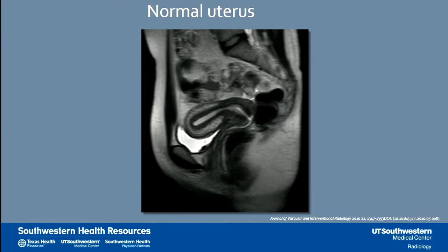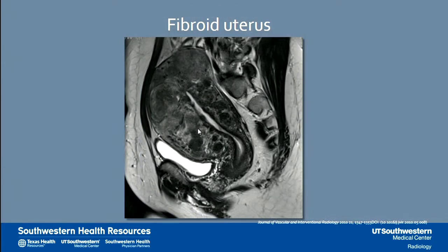Here is an MRI of the pelvis — a sagittal T2-weighted MRI. We know it's T2 because fluid is bright. This is a normal uterus, showing the fluid-filled endometrial cavity, the lower signal myometrium, and the more high signal endometrium. This is a fibroid uterus — you can see it's remarkably different. It's a large, bulky uterus distorting the pelvic contents and compressing the bladder, which is why a lot of patients experience urinary frequency.